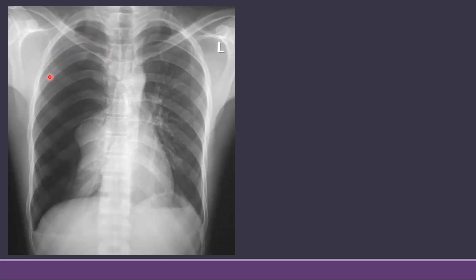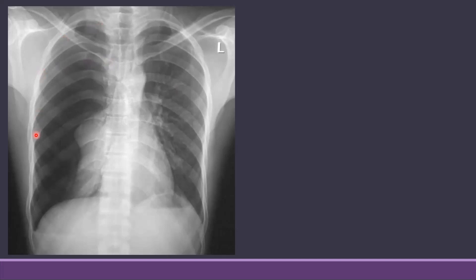...on the right side it appears more black as compared to the left side. And if you have a closer look, you can see that there are white linear shadows, or linear marks, in the left lung which are not present on the right side. These linear shadows are called vascular markings, which are present normally in the lung.